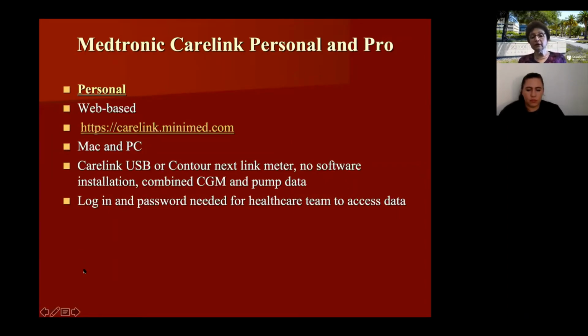We do need your login and password for the clinic to get one-time attached to your file, but then once we connect it to the clinic, we don't have to. But if we're doing it from home, or just reviewing the data, then we usually need your login and password.